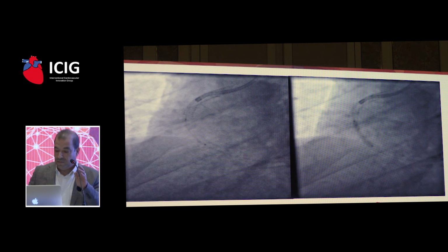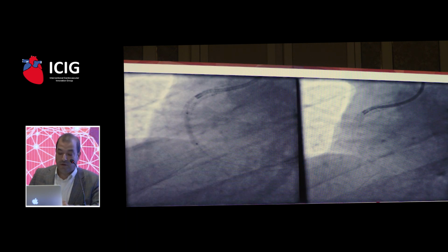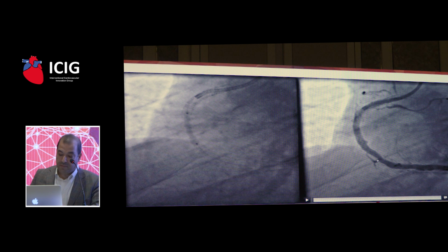So we kept ballooning, trying to open this strut in order to cover this part that was shown. And you can see here, apparently, this is what I'm telling you. The nature of the vessel, the native RCA, was definitely distorted after having the stent. This image was not there before placing this stent and the migration and fracture of that distal part.